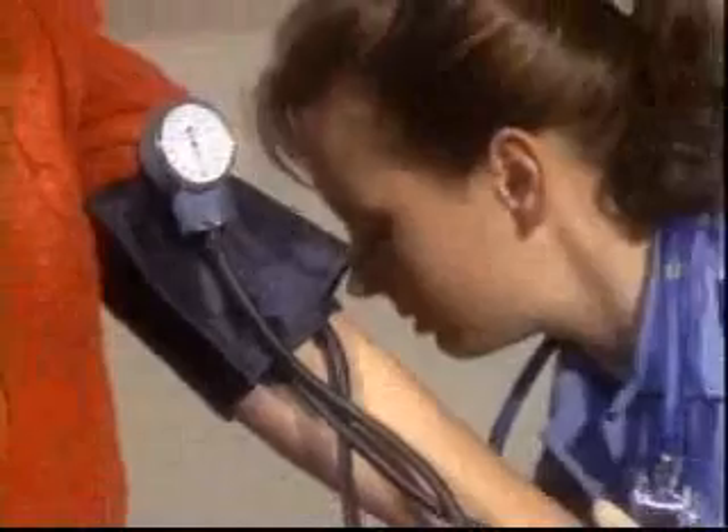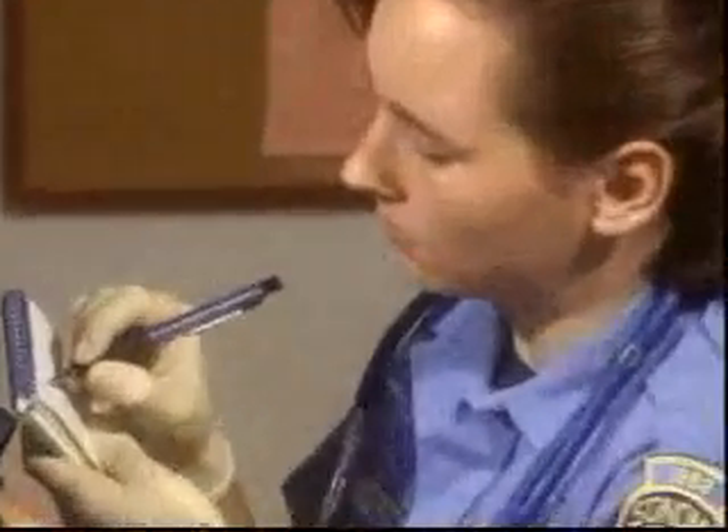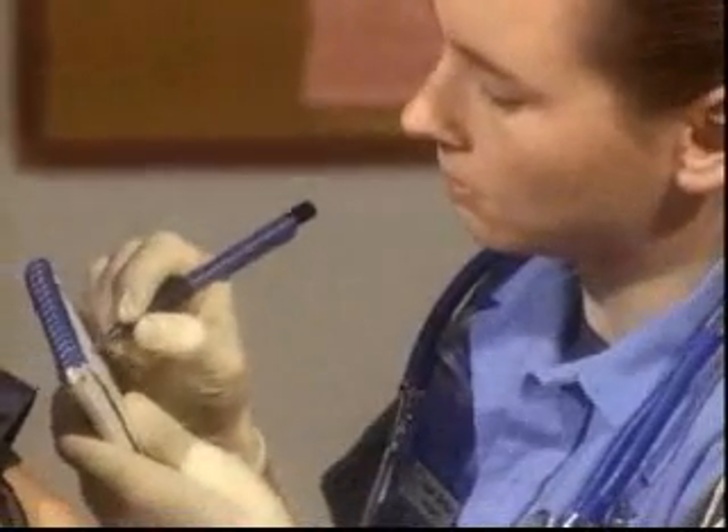Open the valve to deflate the cuff completely, but leave the cuff in place to save time for sequential readings. Record your information as soon as possible to avoid forgetting it. Be sure to repeat the readings over time to check for changes in blood pressure as the patient progresses.